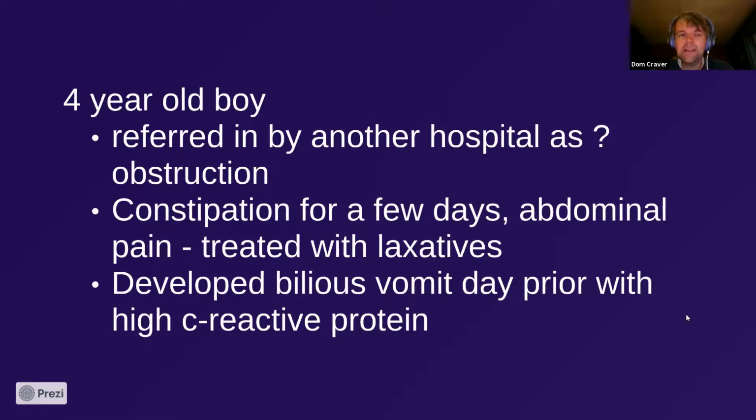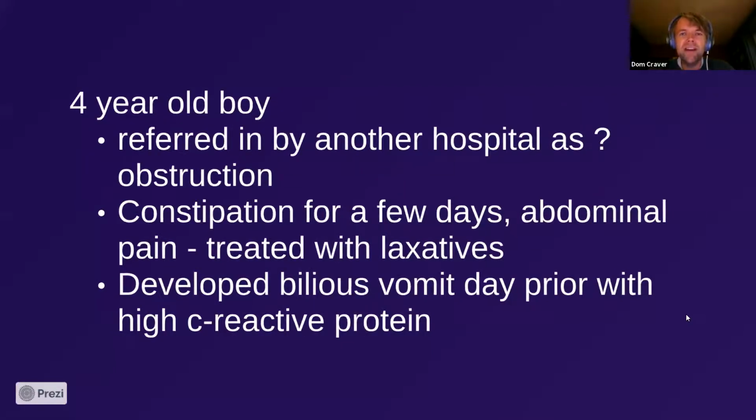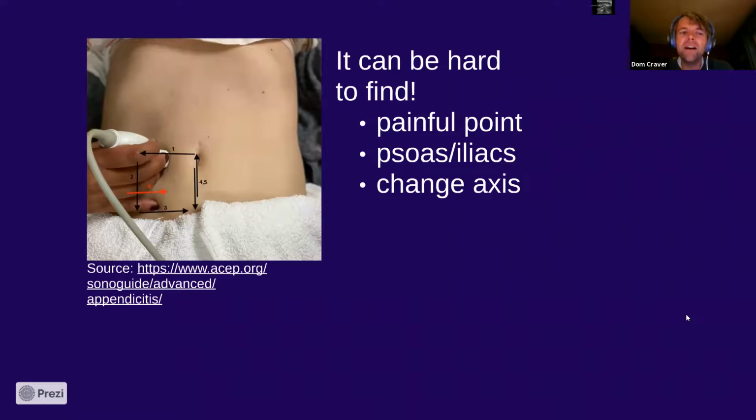But ultrasound does help them, and it may help us in the future differentiate these children. Anyway, sorry to see him. Before I do that, obviously, how do we find it? It is really hard. Again, this is from ACEP. There's a really good article about ACEP, but you can have all the links, just write these links down.